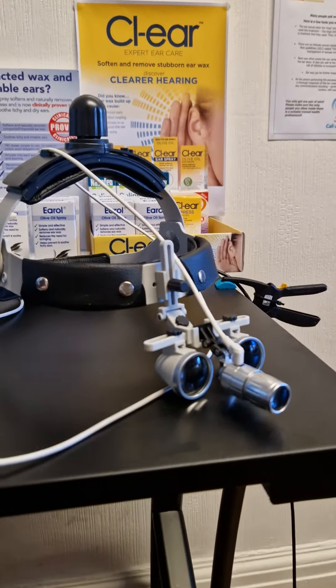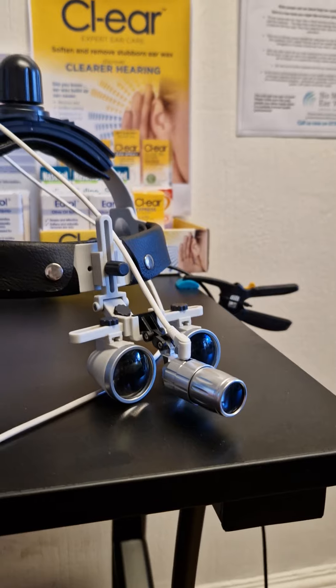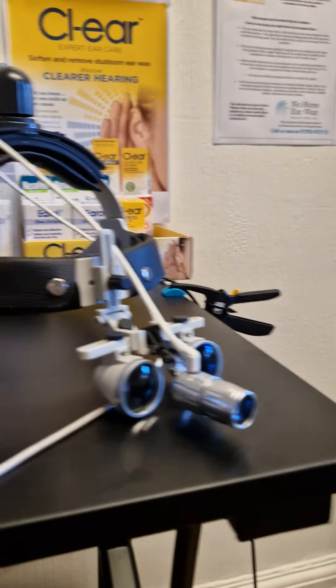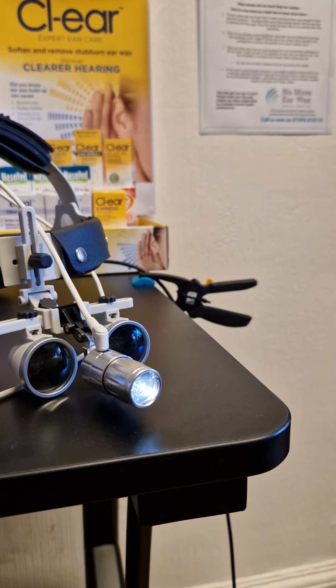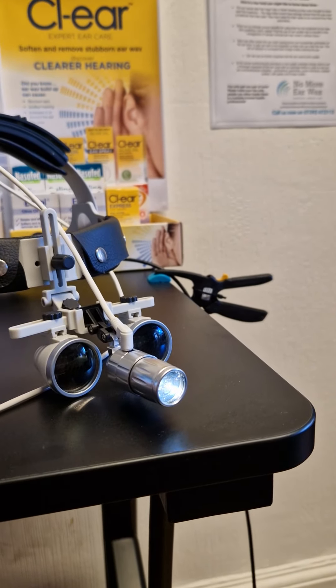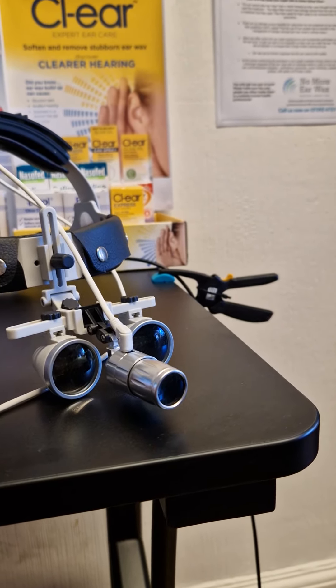How we do the procedure is using these, which are called loops. These two are microscopes and they've got a torch attached — press this button here and it shines a bright light inside the ear canal so we can see what we are doing.